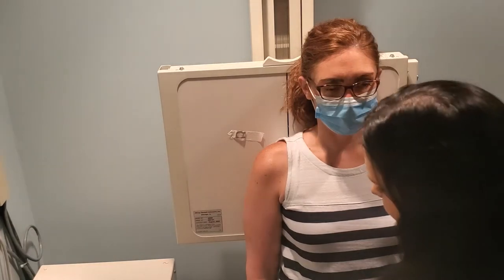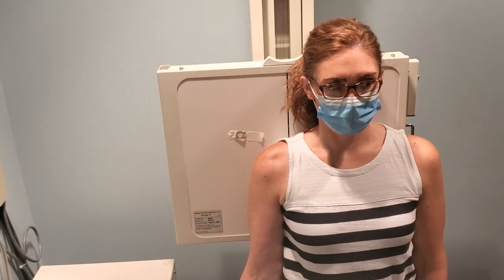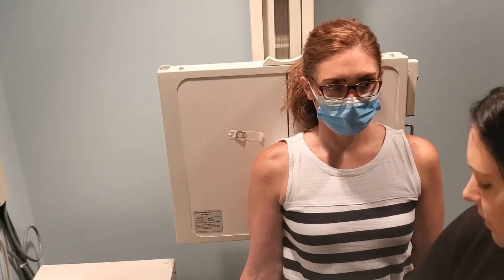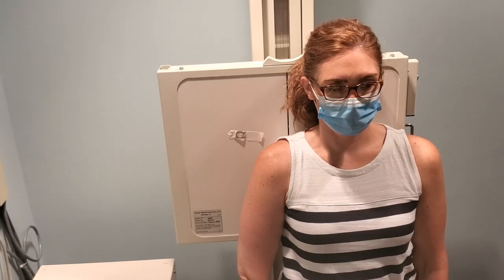You're all going to want to pull these three because from here, all you do for external rotation is have the patient supinate their hand up. That's going to move the greater tubercle out externally, so it's going to be on the lateral side of the humerus, and you're going to have the humeral head medially. For internal rotation, have the patient turn their hand in so the back of the hand is resting against the hip. That shows the lesser tubercle in profile medially, and the greater tubercle moves over the humeral head, so it's just going to look like a rounded humeral head in the image.